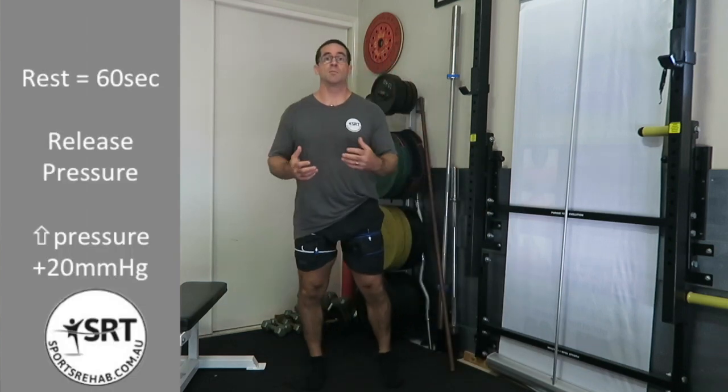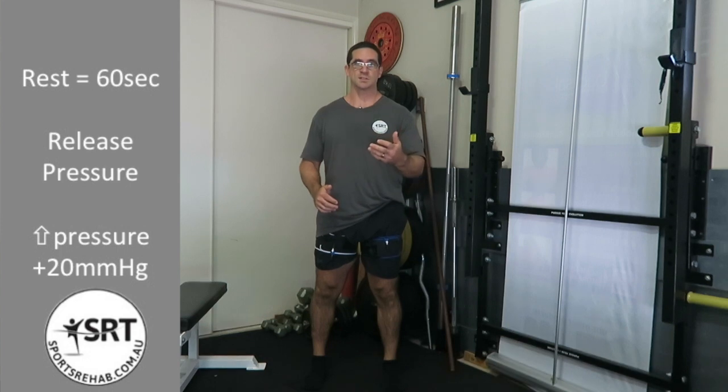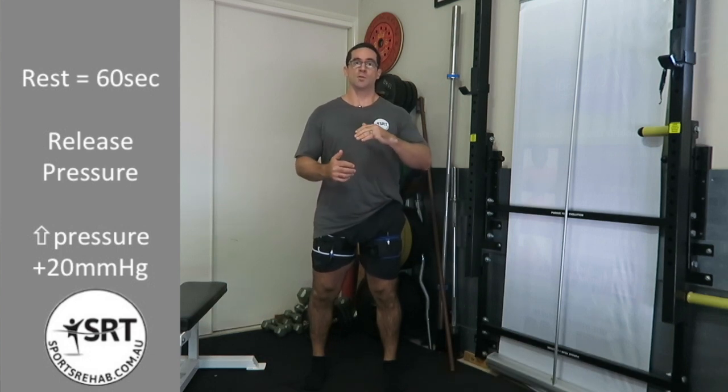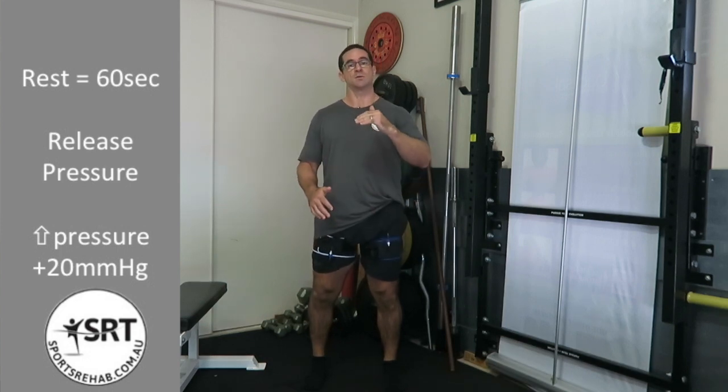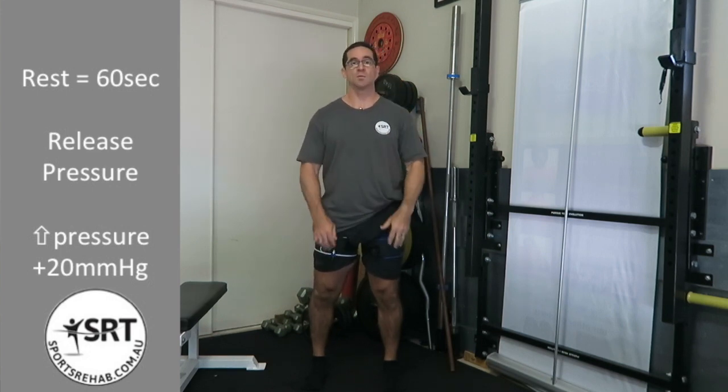Once I've finished my first set, I release the pressure and give myself 60 seconds rest. I then reinflate the cuffs up another 20 millimeters of mercury, repeat that, and do that for a total of 3 sets. Once I've done, I release the pressure. From that point, I find I've got really nice activation in my quads, my joints feel really good, the pain has decreased and I'm ready to go on for my day.